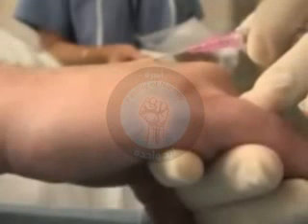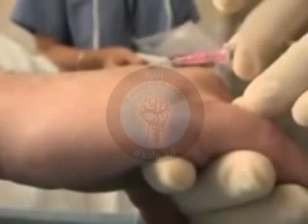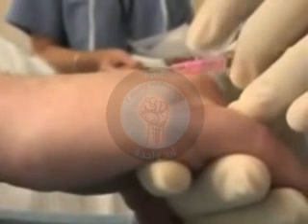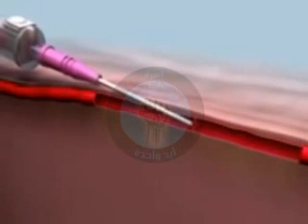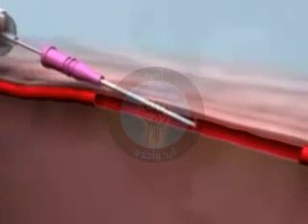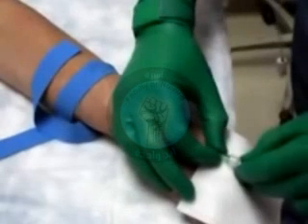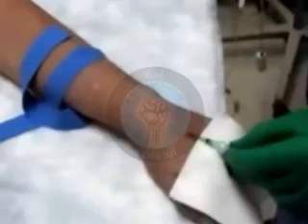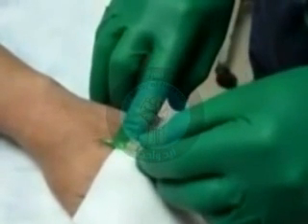This problem can be avoided by reducing the angle of the catheter and advancing the needle a few more millimeters into the vein. A valve within the vein may prevent advancement of an inserted catheter. If this occurs, hold the cannula hub in place, remove the tourniquet, and connect the intravenous tubing to the cannula. Running fluid into the vein may open the valve and allow the cannula to be completely inserted.